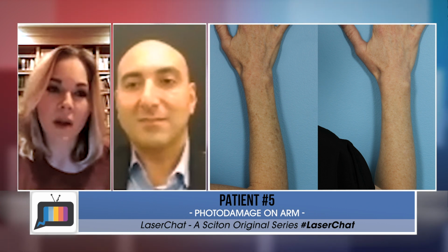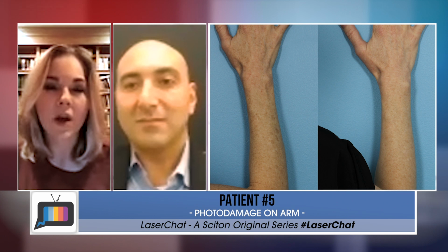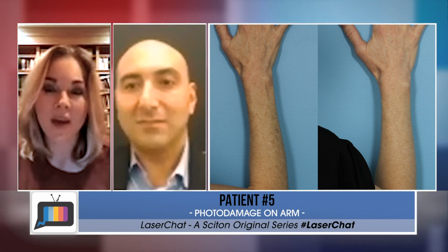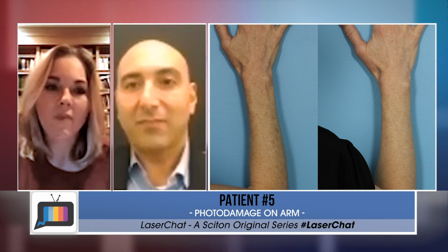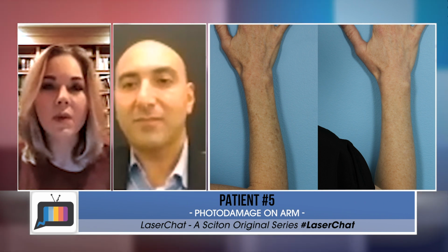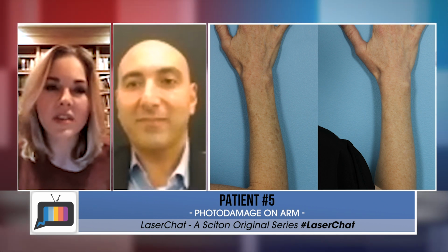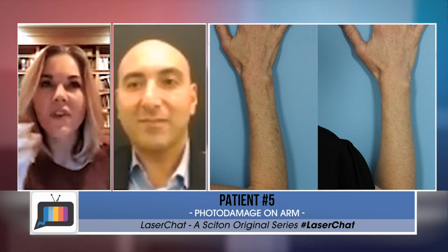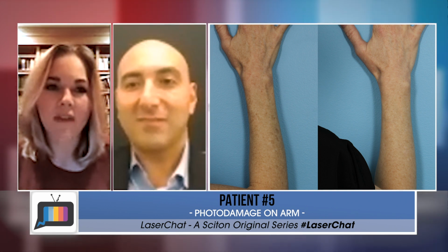And then we'll follow it up immediately with a 1927 with a Moxie, and usually we'll be treating as high as we can with the Moxie, so 20 millijoules and 20% coverage. Patients have maybe 2 to 3 weeks of what just looks and feels like sandpaper. It looks a little dirty, but it's not really obvious downtime.